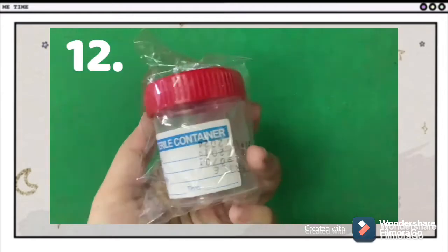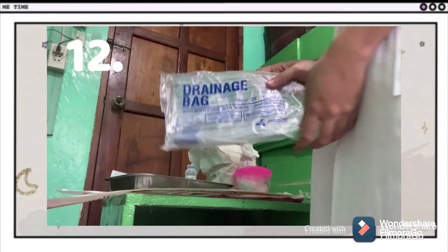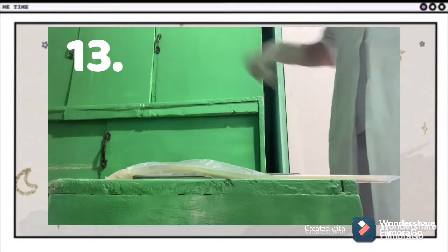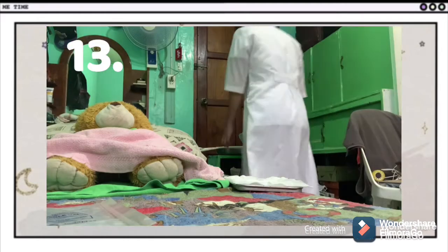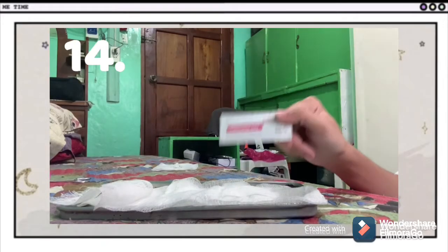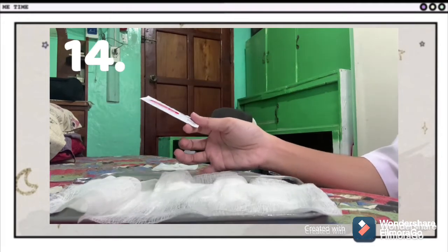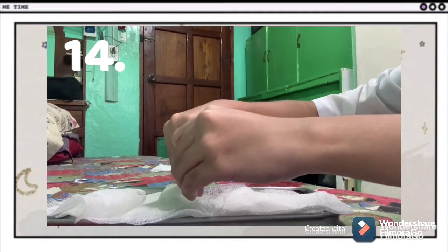Prepare the urine receptacle and tubing if an indwelling catheter is to be inserted. Tubing facilitates connecting the catheter to the drainage system. Open catheterization pack and bring it near the perineal area. Observe aseptic technique to increase efficiency and prevent the spread of microorganisms. Squeeze a small amount of lubricant over the sterile OS placed in a sterile field. Organization promotes efficient time management.